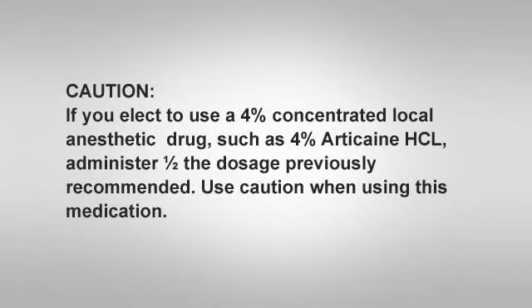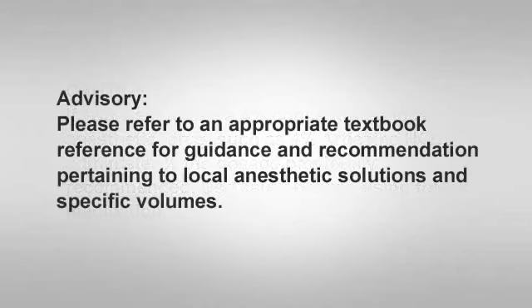If you elect to use a 4% concentrated local anesthetic drug, such as 4% articaine HCl, use 1/2 the dosage previously suggested and use extreme caution when using these medications. Please refer to an appropriate textbook reference source for guidance and recommendation pertaining to local anesthetic solutions and specific volumes. You will find that using the STA system, using the STA wand handpiece and birotational insertion technique will allow you to deliver a more comfortable mandibular block with a greater success rate and a shorter onset of anesthesia.